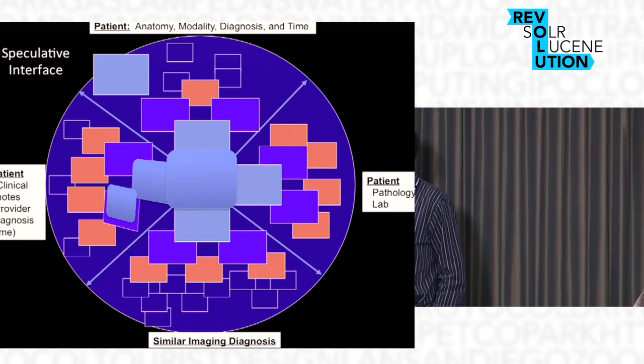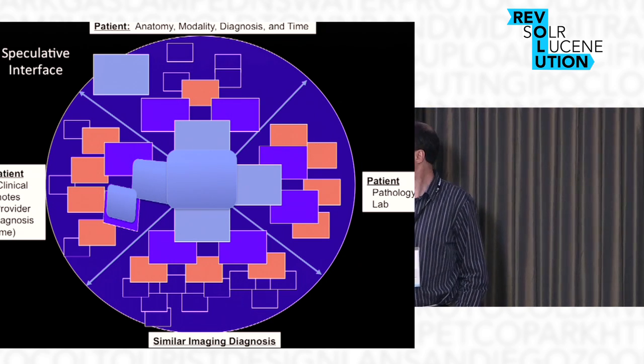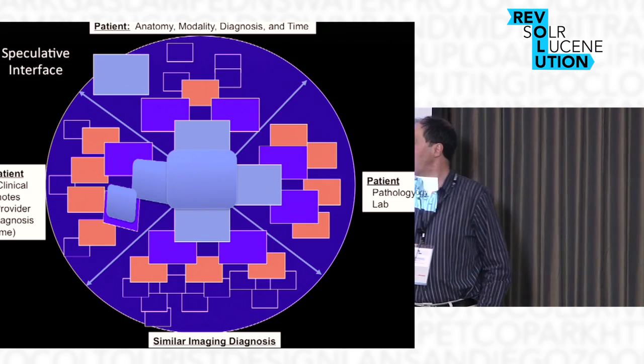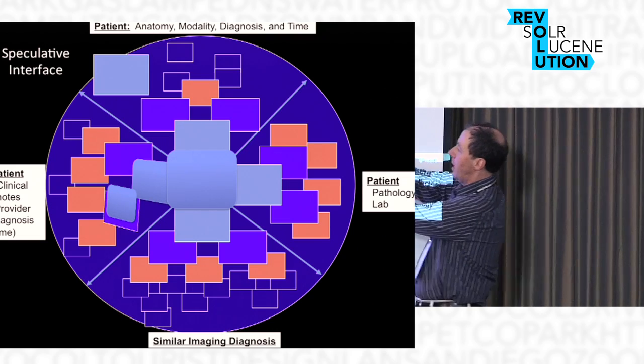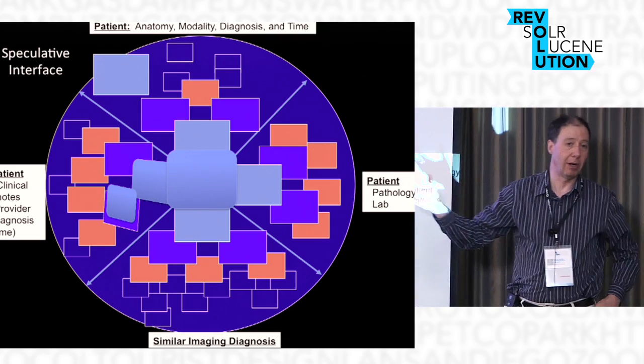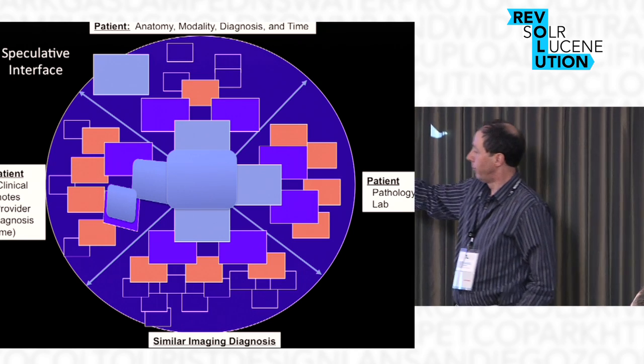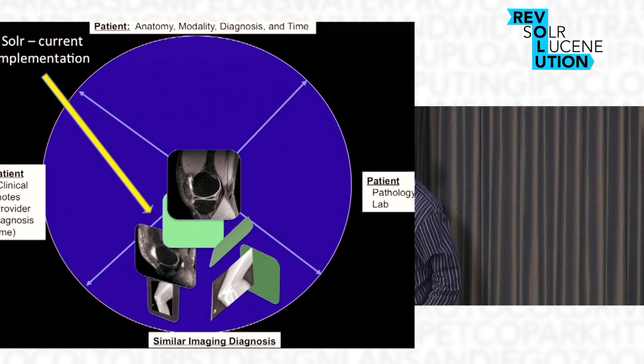So the most pertinent image that we can determine would be displayed here, and the next ones would be here, and then it would maybe even fade. In an example we're going to show you later, we've actually taken this and formed a sphere out of it. And then I guess go to the next one. So as I said, this is where we're going to focus. We've got the main image.